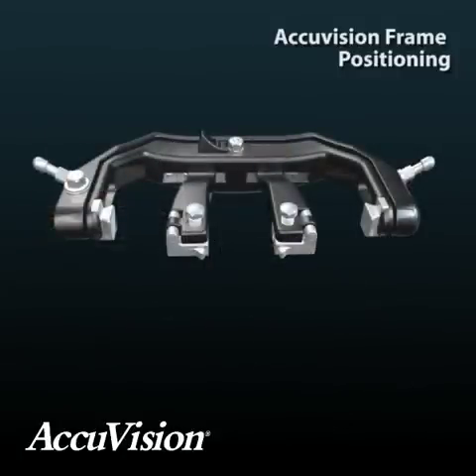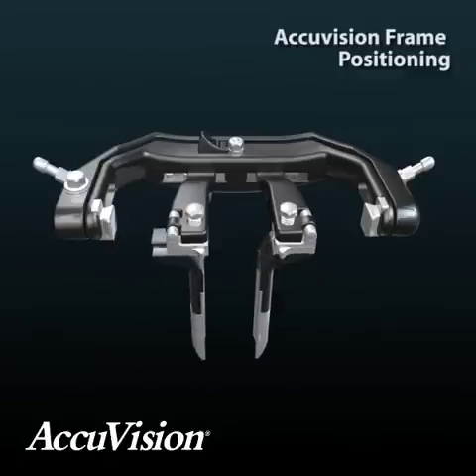The Accuvision frame is prepared with the initial cephalad and caudal retraction blades. Blade length is determined from the depth markings on the sequential dilators. The blades are attached to the retractor arms with the curved portion facing the center of the frame. When secured into the dovetail lock of the frame, an audible click is heard.